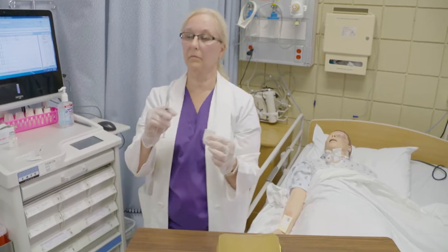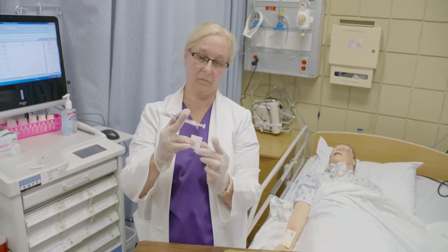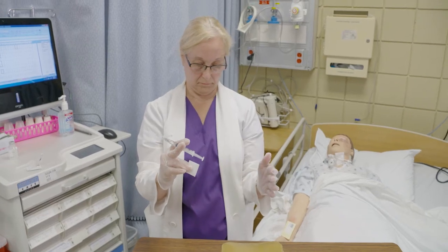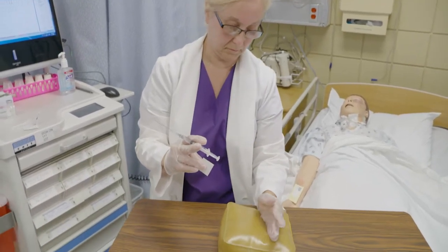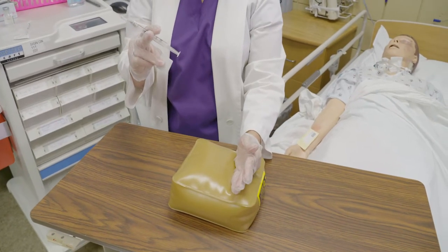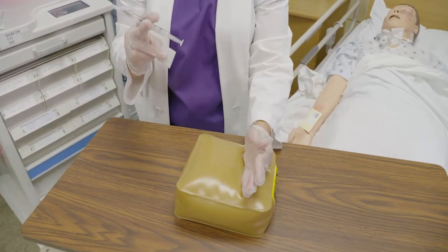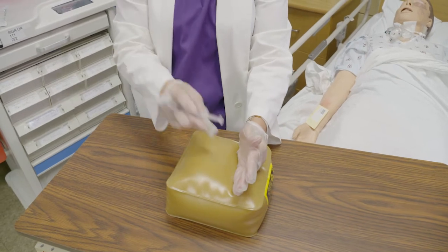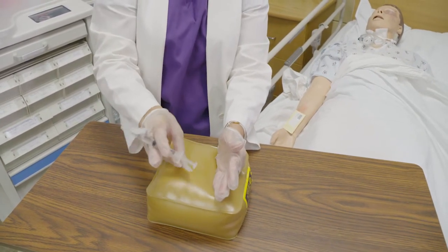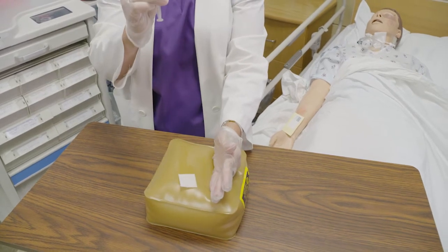Hold the alcohol pad between your ring finger and thumb. Using your non-dominant hand, slide the muscle aside using the side of your hand and hold the muscle in place. This helps the medication to be injected deep into the muscle. Cleanse the site with alcohol pad in a circular motion. You can lay the alcohol swab near the site.